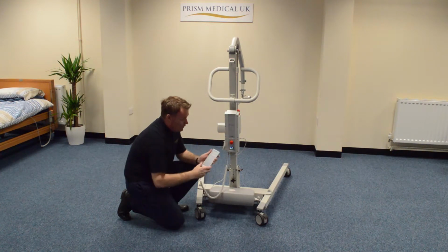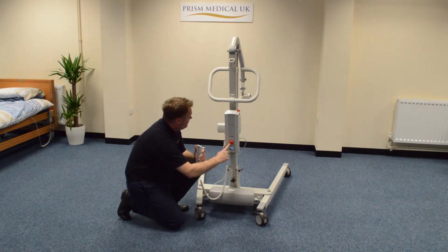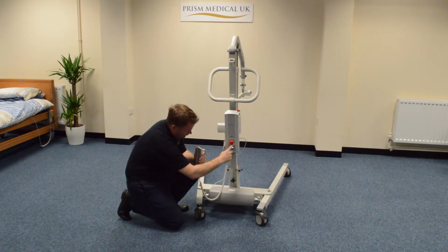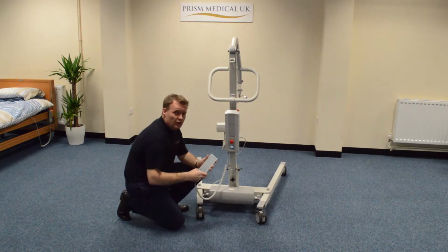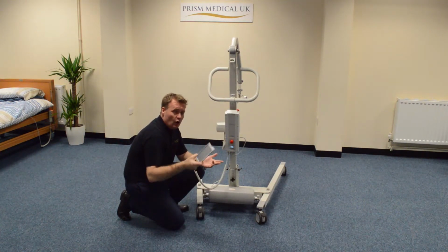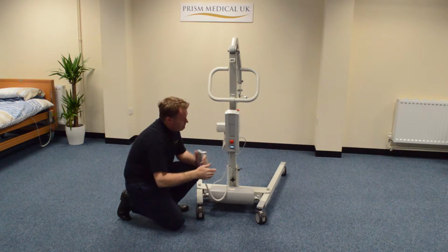Also on the control box, should there be an issue with the handset, we have additional buttons to raise and lower the hoist, to close the legs and to open the legs, thus giving continuous use of the hoist should there be a problem with the handset.